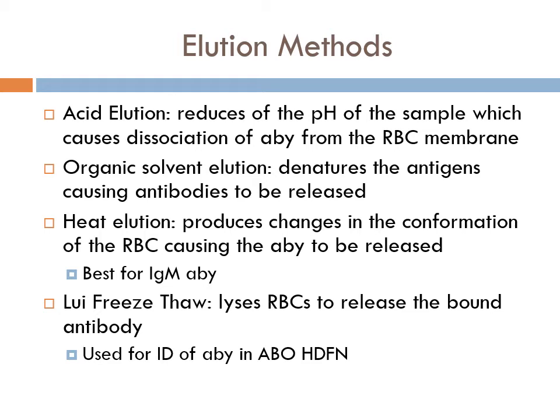With acid elutions, again, we're not leaving you a whole lot of good red cells to deal with because we're really only concerned with what antibody is in the eluate, which was attached to our red cell. Organic solvent elutions denature the antigens and cause the antibodies to be released. A lot of times these aren't used very widely because they use cancer-causing solvents.